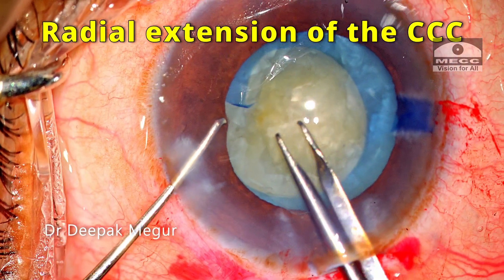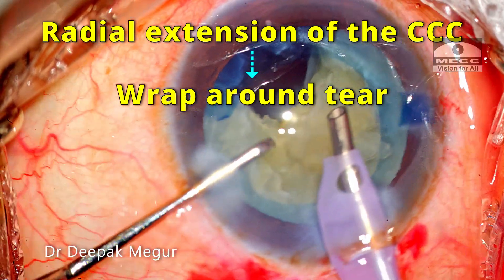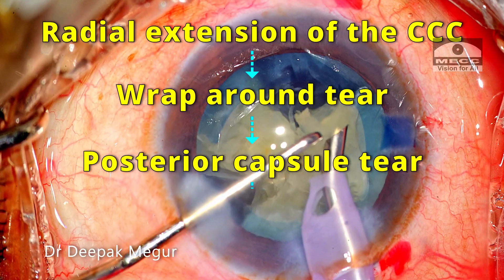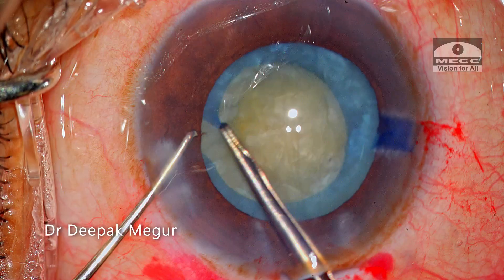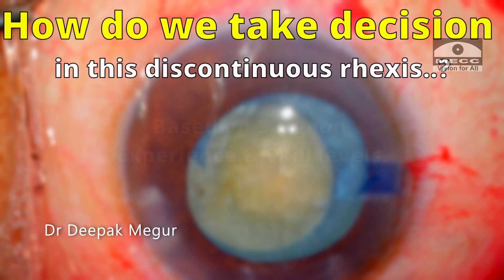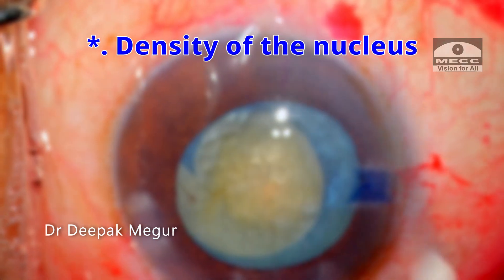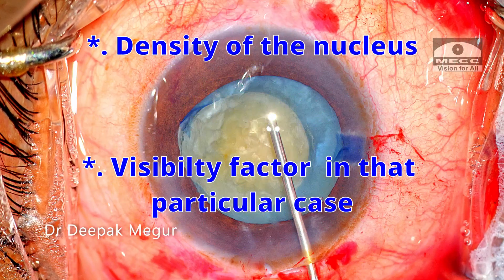To summarize: a discontinuous rhexis creates a weak area in the anterior capsule opening and carries the risk of a wrap-around tear extending to the posterior capsule during nucleus manipulation, with a high risk of nucleus dropping into the vitreous. In the event of a discontinuous rhexis, the decision to perform phaco or to convert to ECCE or SICS should be purely based on the experience and skill of the surgeon, the density of the nucleus, and the visibility factors in that particular case.